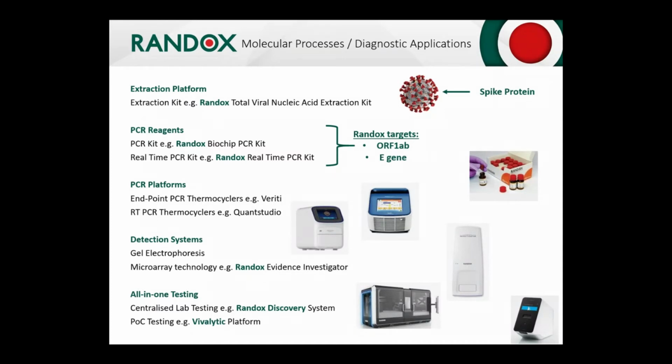People can travel if they know they've got a negative test result within 30 minutes of boarding their flight. So again, it makes things very accessible to the majority of people now. Beyond the point of care, we see a lot of all-in-one solutions coming on the market, for maybe the more medium throughput labs. Where do you see that type of technology moving?